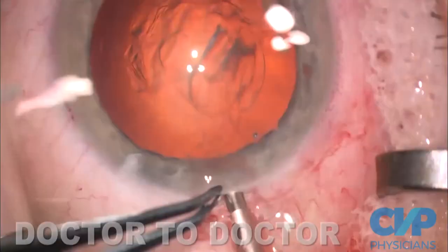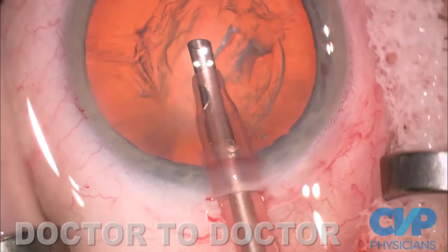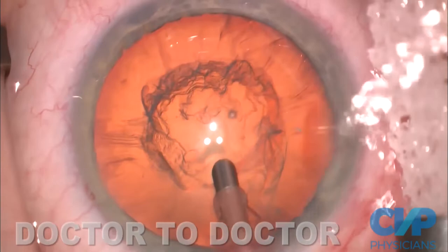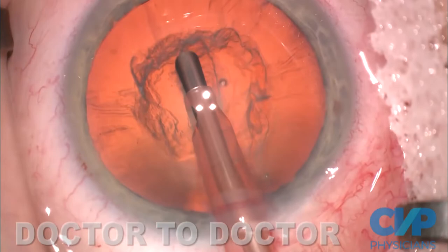I aim to the middle of the pupil and make my second stab. Now I go into the incision. There's only a tooth on that one shaft, so I don't mark the epithelium. This is my own favorite bevel-down phaco, so I make sure all the energy goes backwards and not at the cornea. I just outline where the rhexis is — that way I'll never hit the edge of the rhexis accidentally. I go into the lens, into the nucleus, and make a few runs bevel-down. I make sure it's an in-situ groove — I don't push the lens.